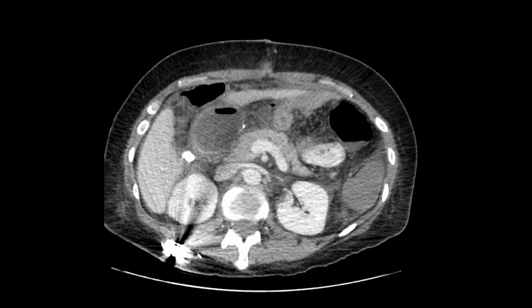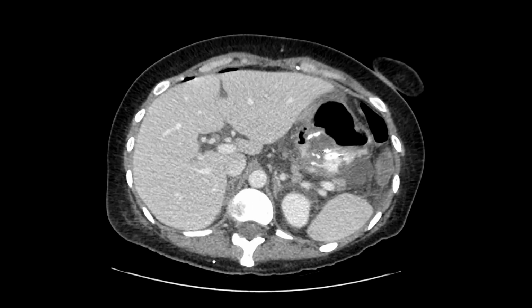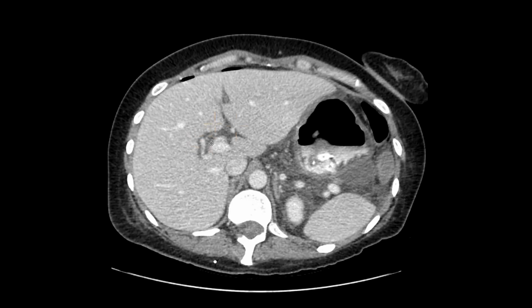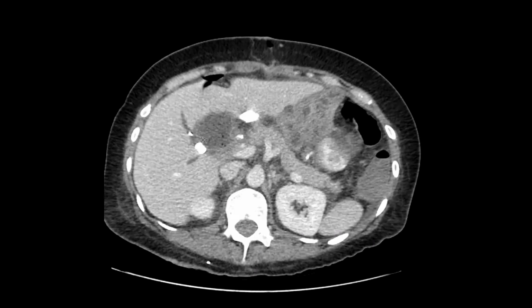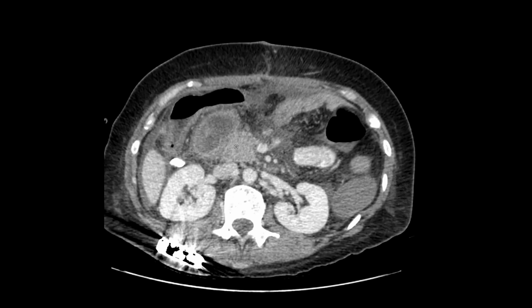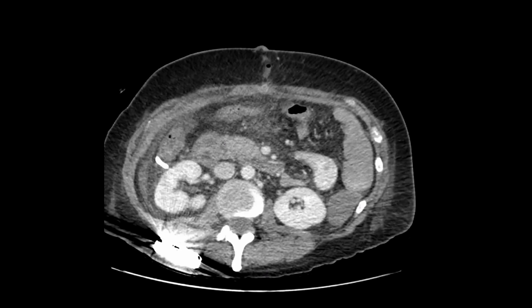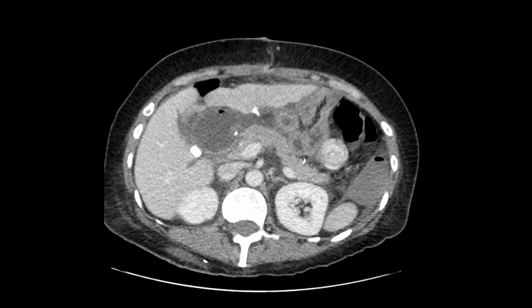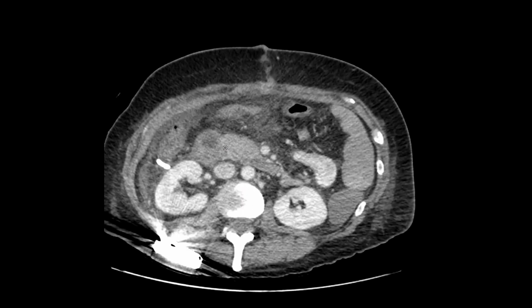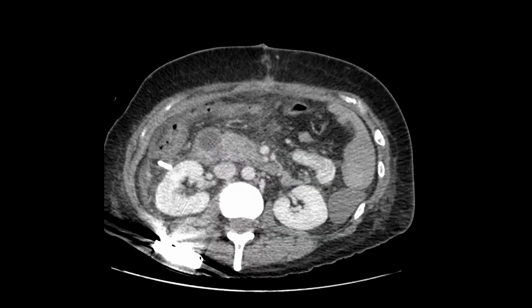No obstruction. Now, remember what I said about the duodenum? You can't just get rid of that. So you have the liver with the bile ducts, and I'm over here, if you can see the cursor. The common duct has to come down here into the pancreatic head and then connect up to the duodenum. The main pancreatic duct, which you can't see, here's the pancreas. I'm just going to follow it for you guys. That has a duct that's supposed to dump also into the duodenum. Here is a piece of duodenum.